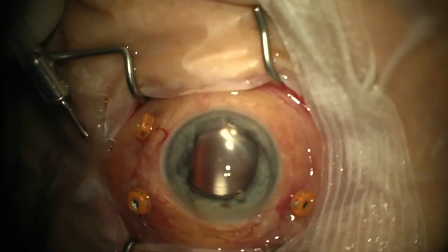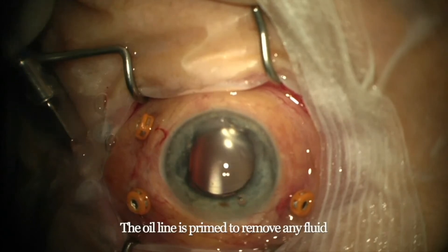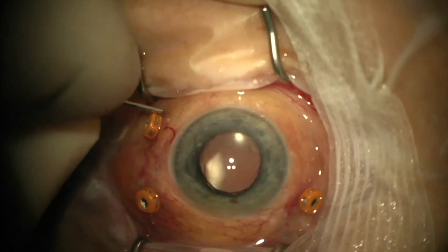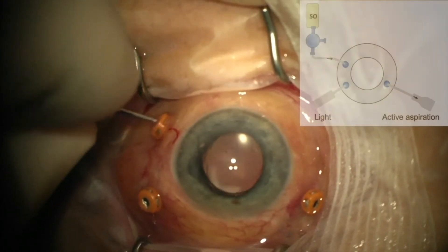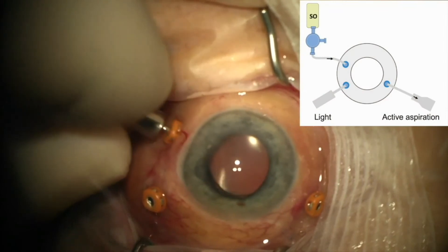This is a 23-gauge vitrectomy setup. The initial step is to take the infusion cannula out, prime it with oil, and put it back. The photograph insert shows the rest of the setup with the active extrusion and the light pipe inserted through the superior trocars.